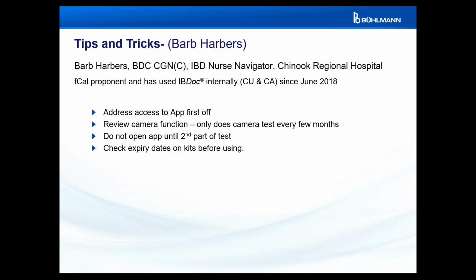And after training the site and then having them send out the IBDoc to their first set of patients and actually having the patients follow up. So there's definitely a broad diversity of interest that healthcare practitioners provide when training their patients, and it sounds like what you're doing is working very well.